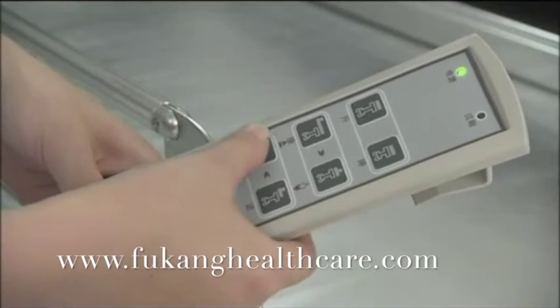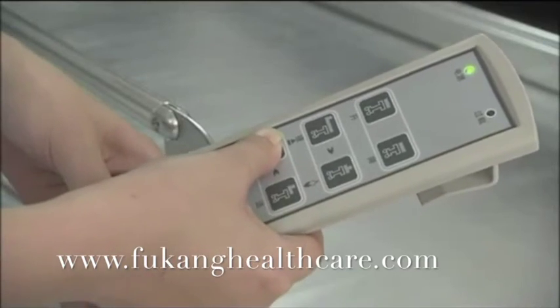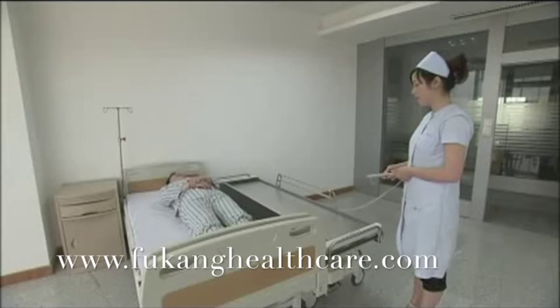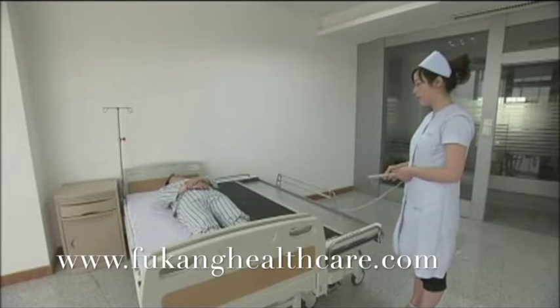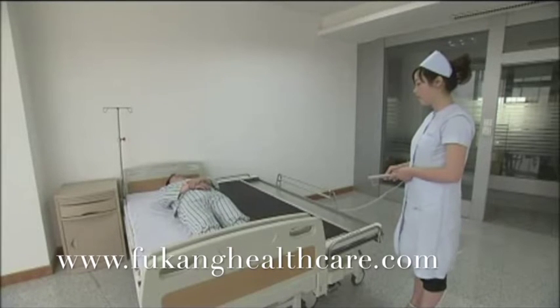Finally, press out. The transfer panel is retracted and the patient is left on the bed without any movement.